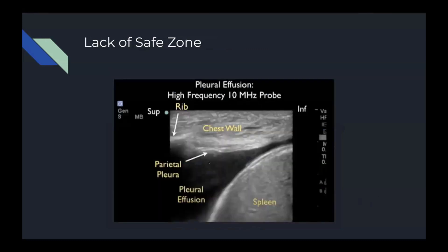Here is an example where there is a lack of a safe zone. You can see the spleen and the diaphragm being very close to the chest wall or the parietal pleura. If a needle were inserted here, when the patient breathes in and out, the diaphragm could expand, stretch, or compress and therefore get damaged or punctured by the needle.